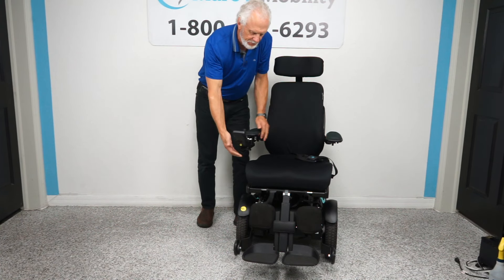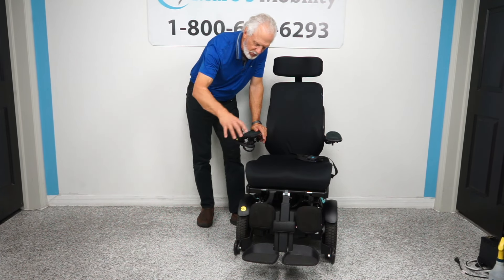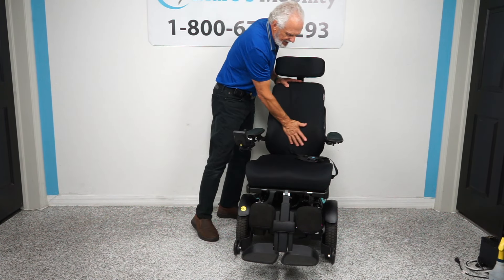This is a swing-away joystick, so the joystick swings out — this enables you to get a lot closer to a dining table without raising your arm or damaging your joystick. If you're left-handed, we can put the joystick on that side and it'll swing to the left. The arms are cloth arms, so you're not going to sweat on them — not that vinyl where the bottom of your arm gets wet.